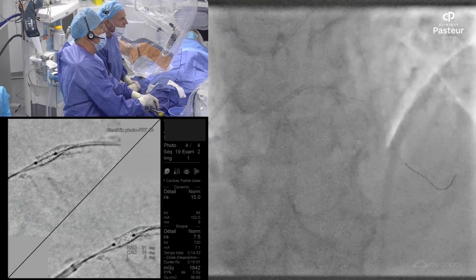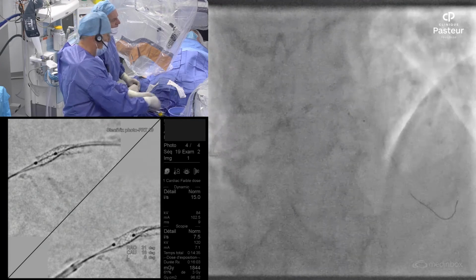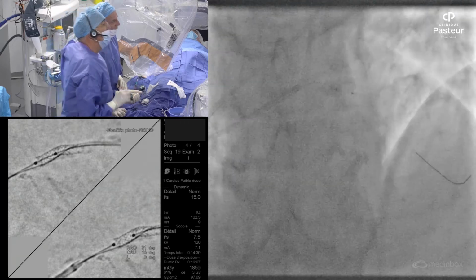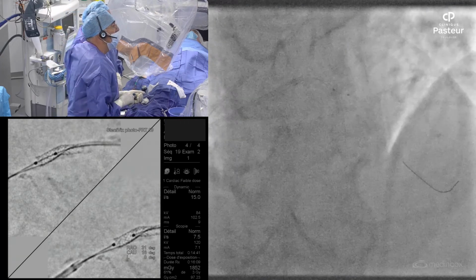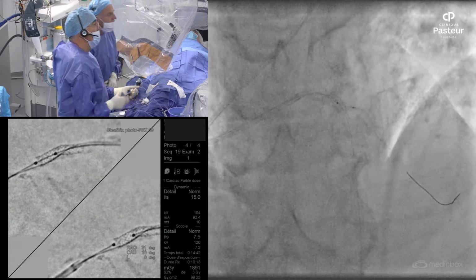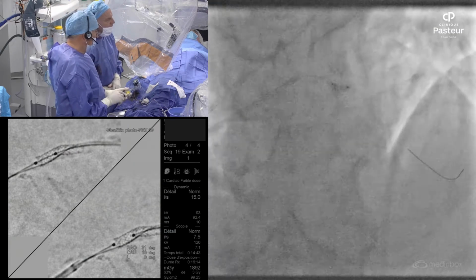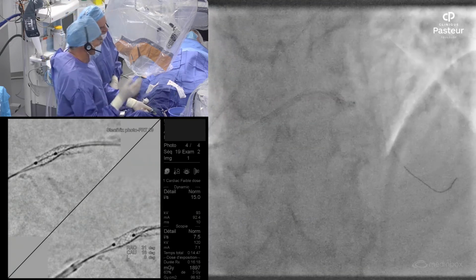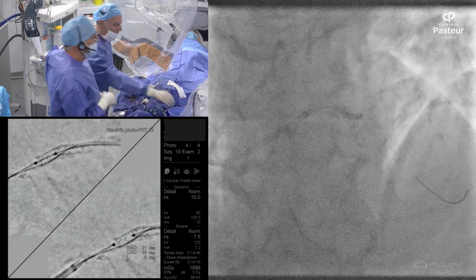Okay, here we are in. I think we can open here. To see an angio? No, maybe without injection. Yeah, we are really in the middle. This is 14 atmospheres. I think it's okay. So we can leave it for 1 minute. Yeah, 1 minute.